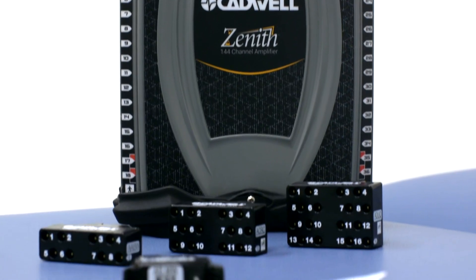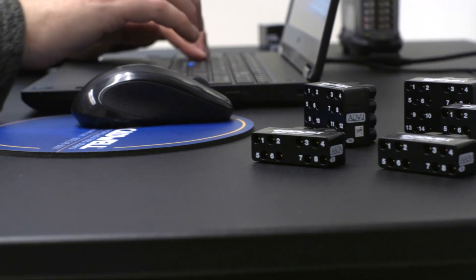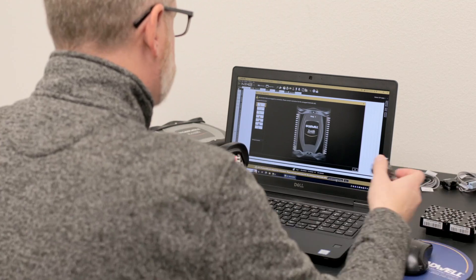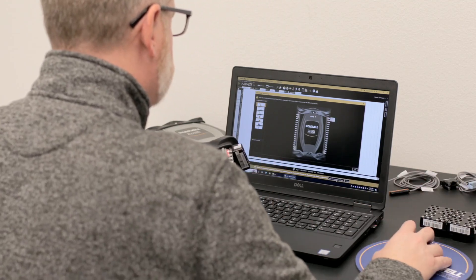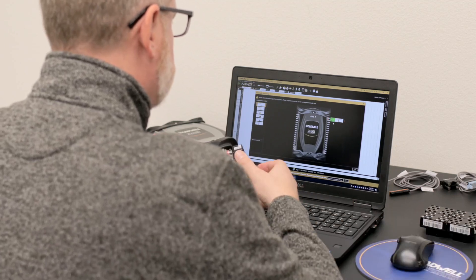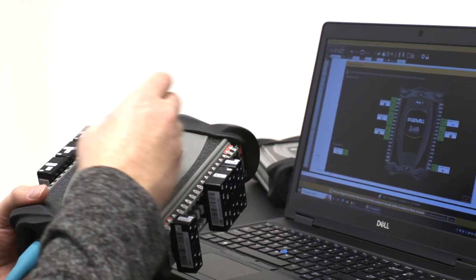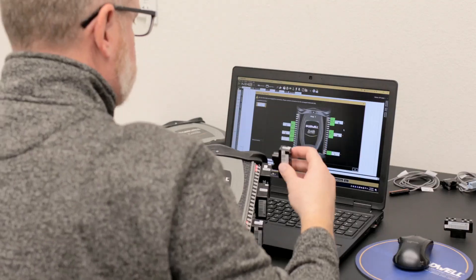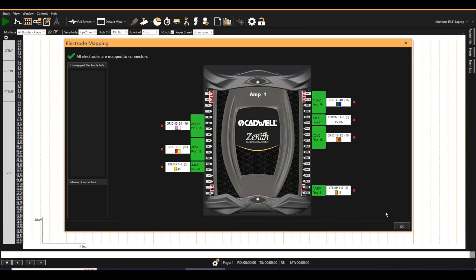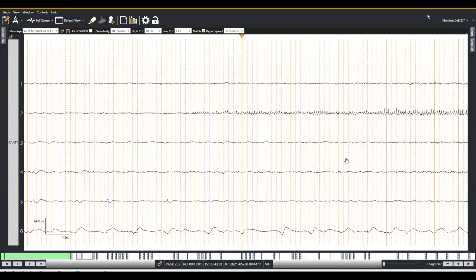Xenect adapters can simplify your operational workflow, save setup time, and reduce connection errors. These magnetic electrode connectors have smart ID chips that auto-identify electrodes after you have assigned them in the ARC software. The connectors can be removed for transport or imaging and later replaced in any order, orientation, and location on any amplifier being used. ARC recognizes and displays EEG waveforms assigned to each Xenect adapter.